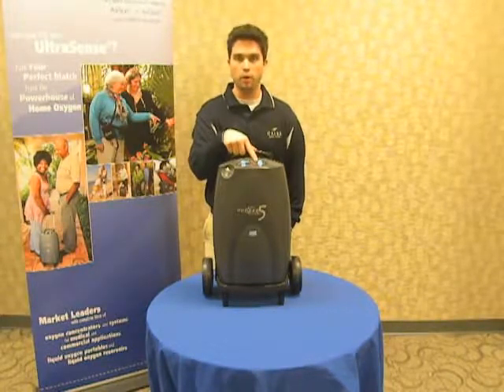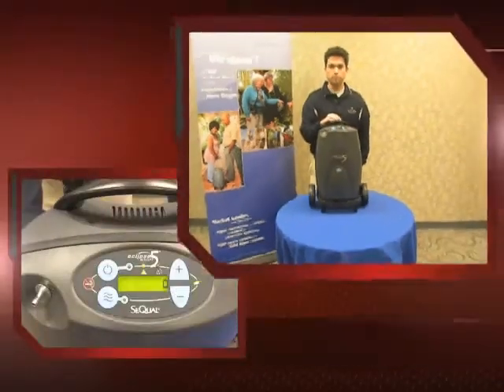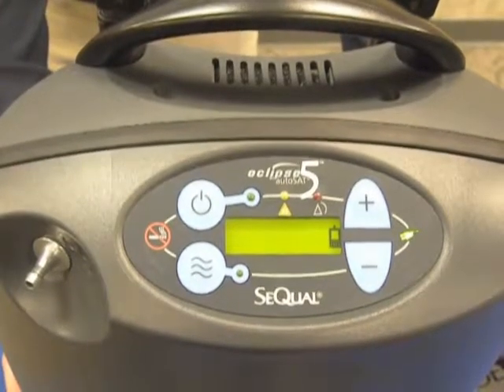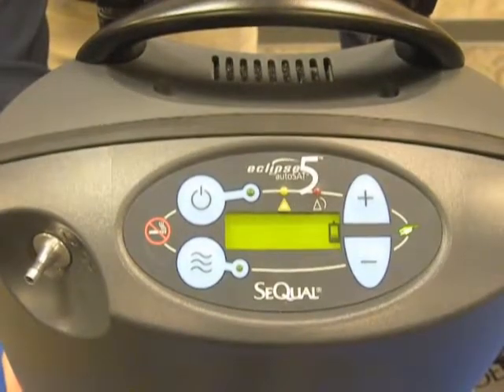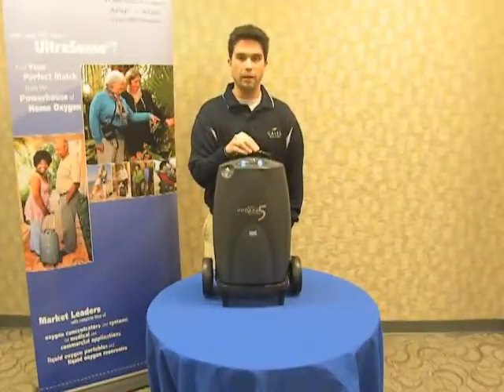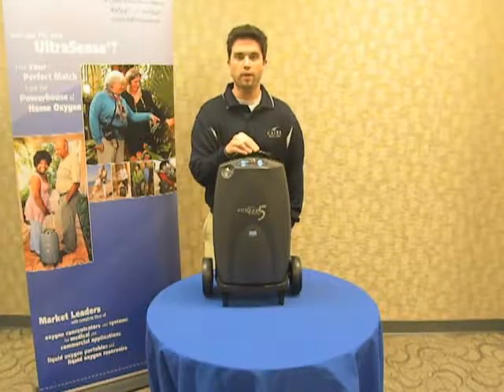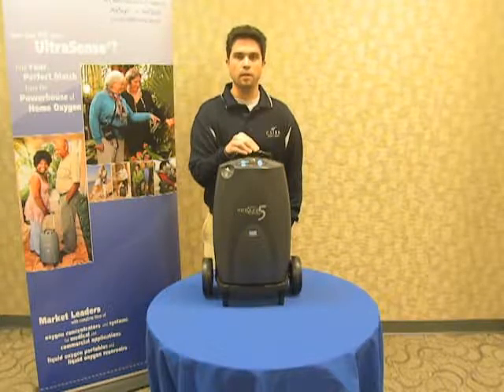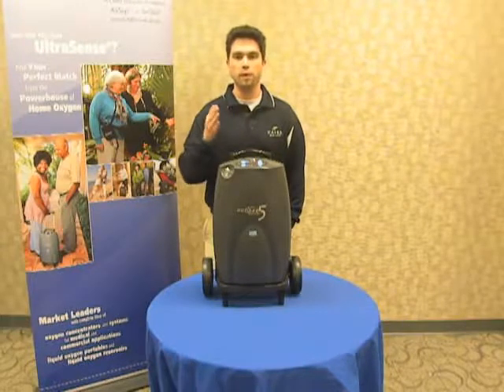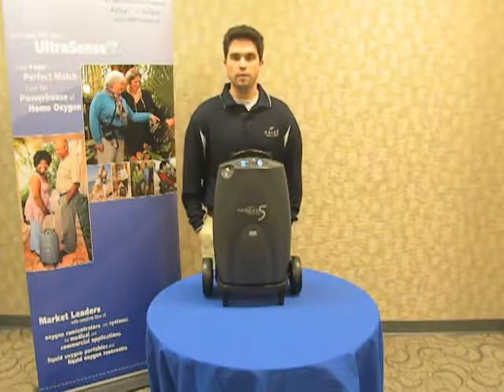This will cascade or waterfall when the battery is charging in an up and down manner, which you'll see here. Note how the battery icon is going up and down to display that the unit is charging. And when you're running on battery power, it will drain slowly, first showing with a full battery a fully charged black icon. As the battery begins to drain or become used, those black bars will begin to become clear or not filled up. So when the battery is no longer black, that means it is empty.